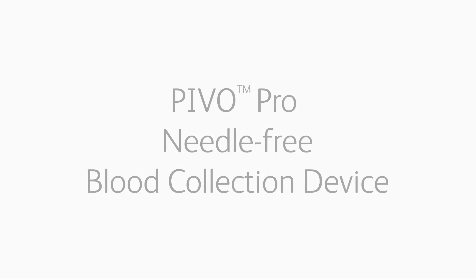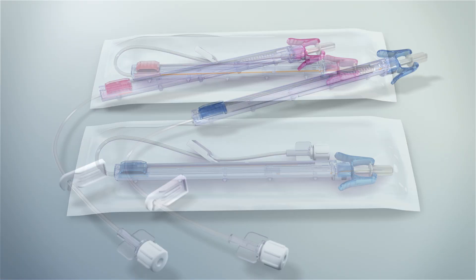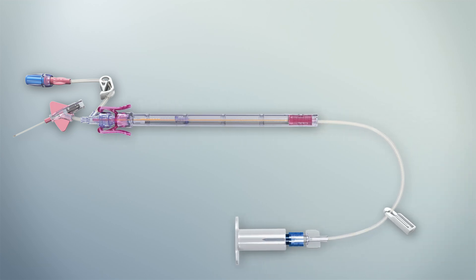PIVO Pro Needle-Free Blood Collection Device is a single-use disposable device that temporarily attaches to a patient's indwelling peripheral IV catheter to collect a venous blood sample.